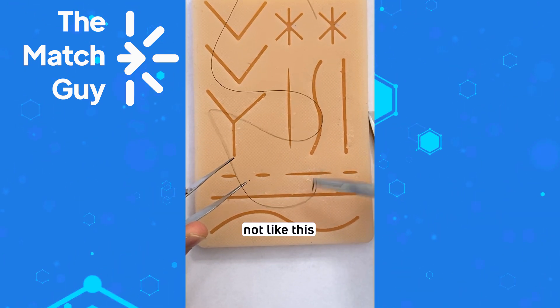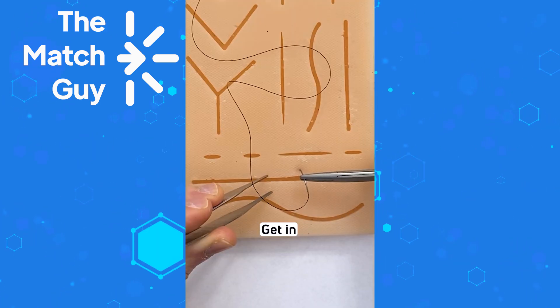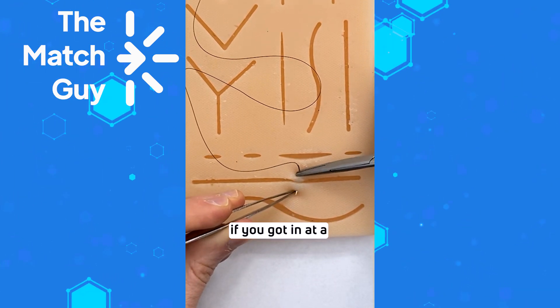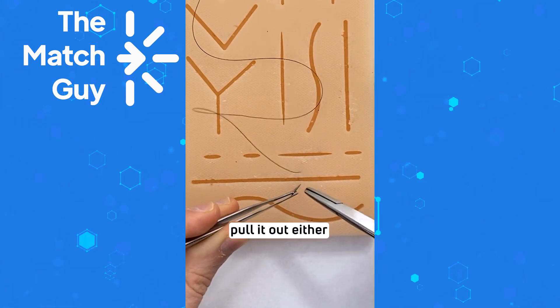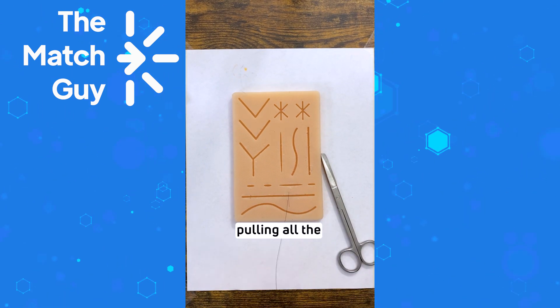Identify the cut that you're trying to suture. Go at a 90 degree angle — not like this — around half a centimeter from the incision. Get in and then pronate your wrist and come out around the same distance that you got in. So if you got in at half a centimeter, come out at half a centimeter. Then push the needle in and pull it out either with the needle holder or with the forceps.